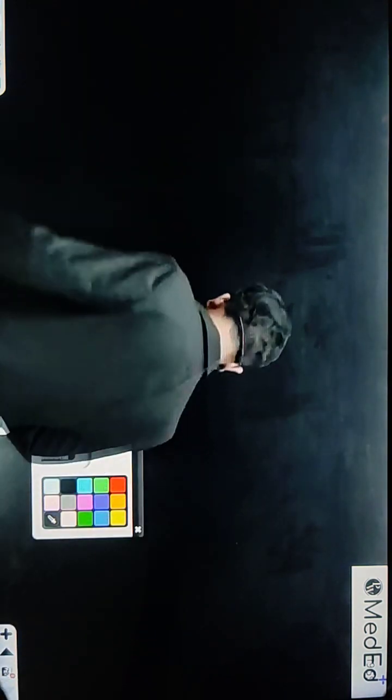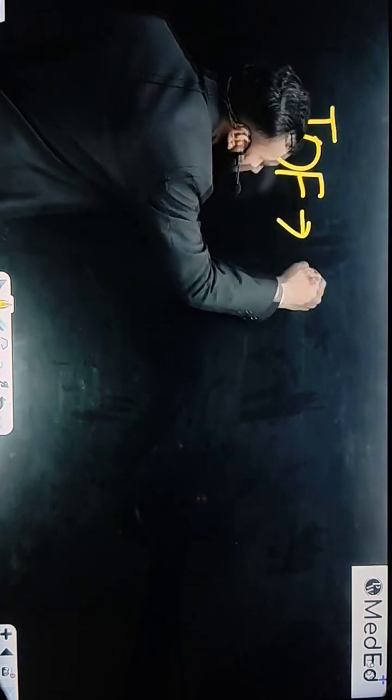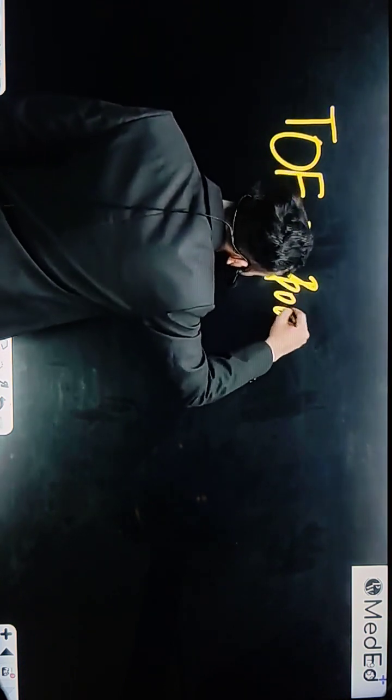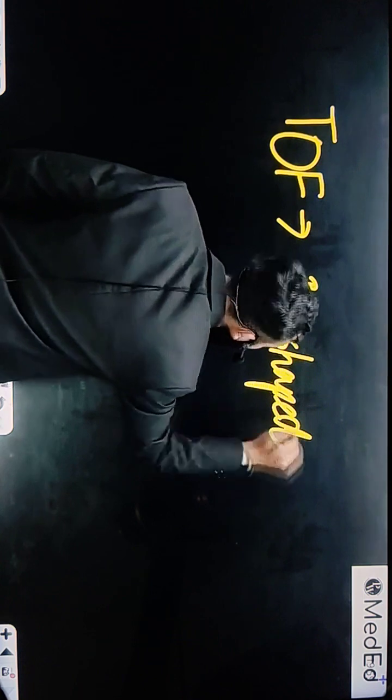So guys, I hope you enjoyed this lecture on congenital heart diseases. You got to understand some more things beside the imaging features. So let me just summarize the imaging features which should be on your tips. So tetralogy of Fallot, you are going to see boot-shaped heart. Remember the 4 features and MAPCAs.